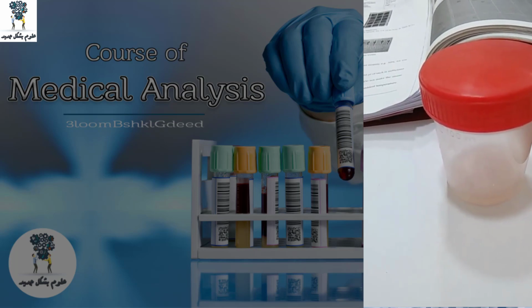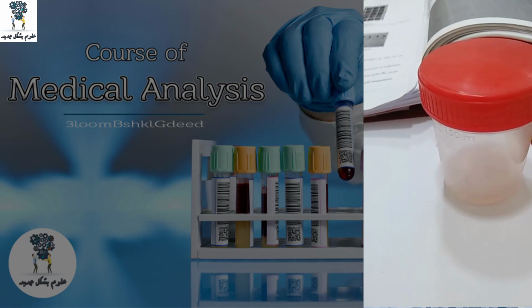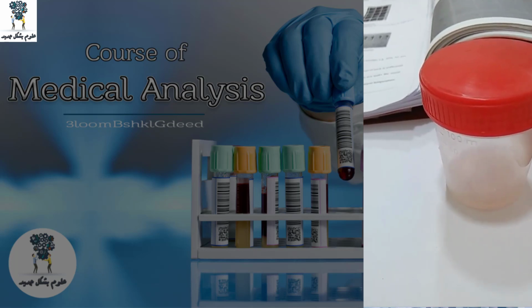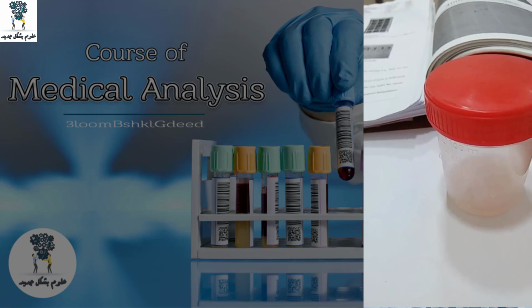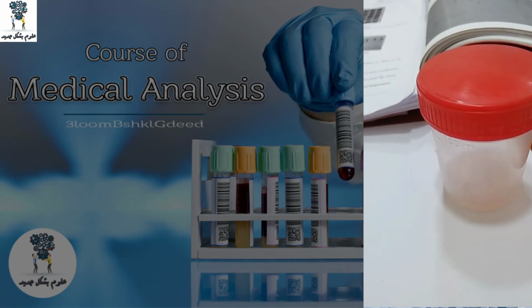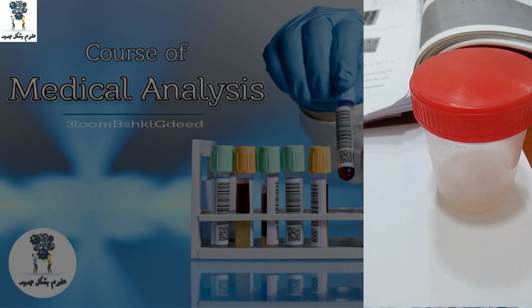So it is good to recommend from your lab different analyses, like I mentioned: if it is acidic, it's a dangerous case, and we should notify the doctor to write fructose in semen.